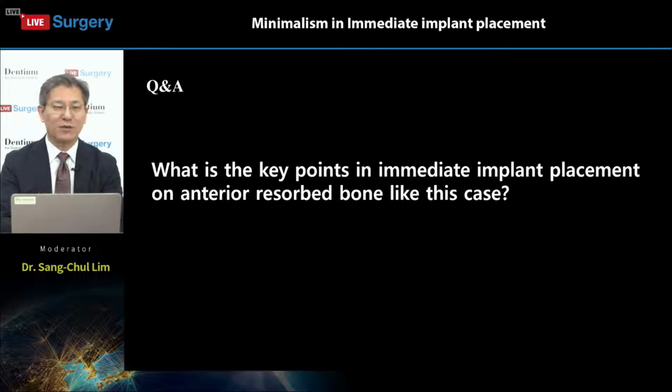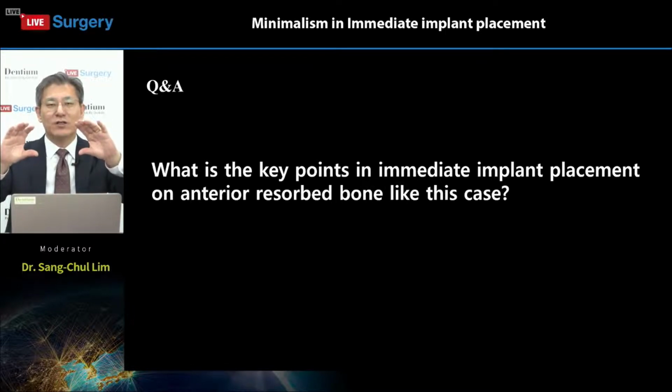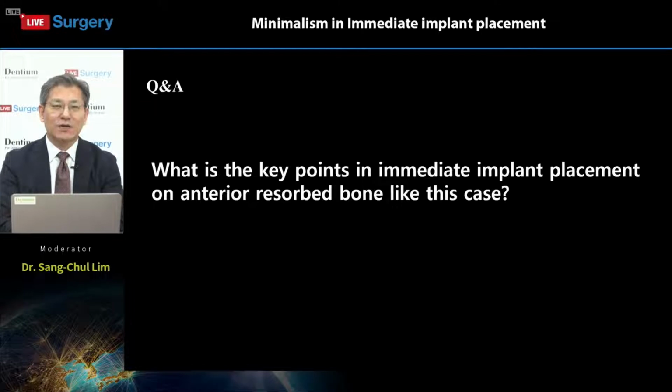All these procedures are very simple, and also we can get the higher insertion torque when we use this kind of the bright tissue level implant. Why? Bright tissue level implant have a little bit fatty belly style. It means round dome shape. The middle portion of fixtures, the wider than apex and top portion. Fatty belly style. So very easy to get the insertion torque, so higher insertion torque. So when you have around 50, 45, it is enough to immediate loading. So these lower anterior areas, good candidate for immediate loading after implantation. So we can go the straightly easy way, immediate implantation and the immediate loading with the temporization with the PMMA or something else, right? Okay.